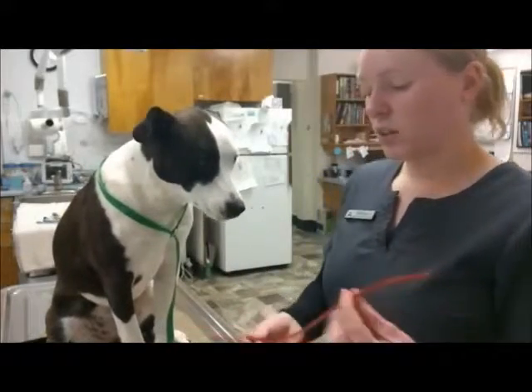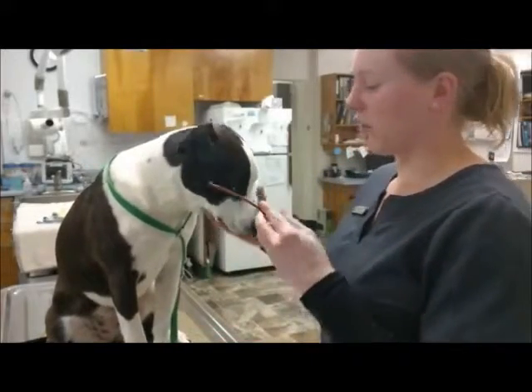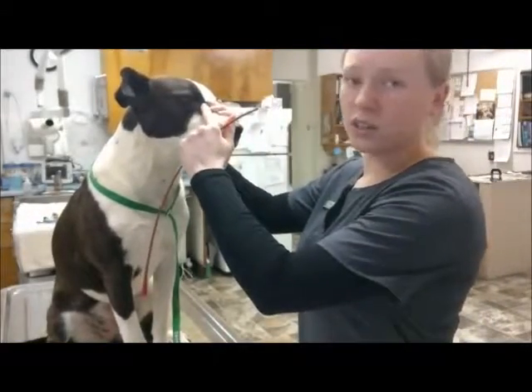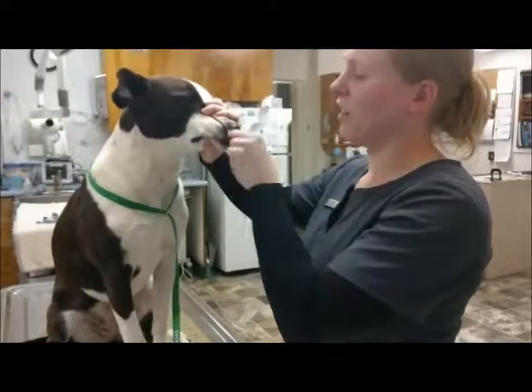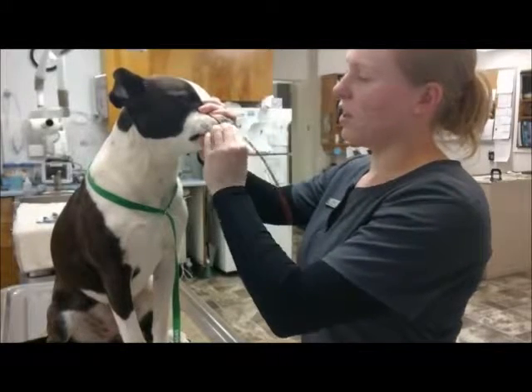To place the red rubber catheter, you would measure from the end of the nose all the way to the medial canthus of the eye, right about here like that, and then mark that point with your permanent marker.